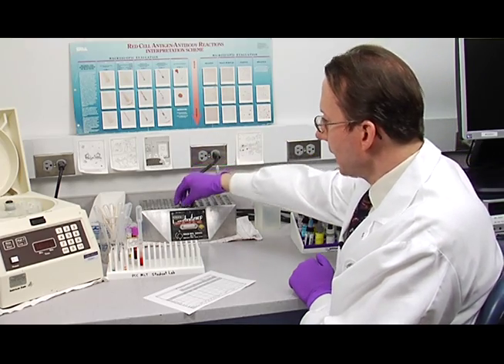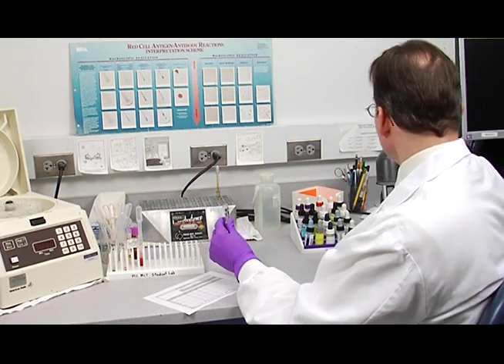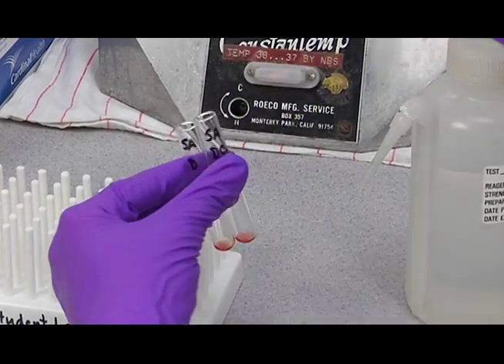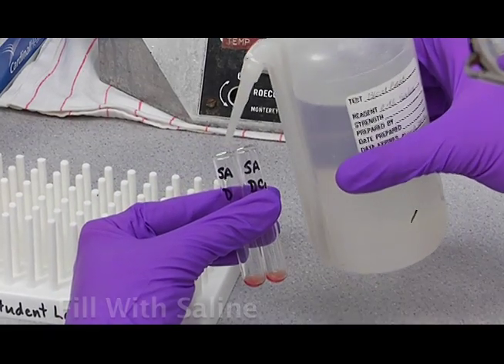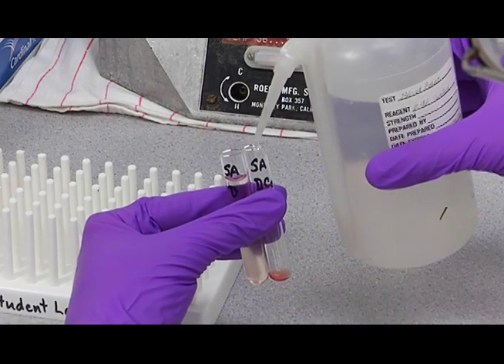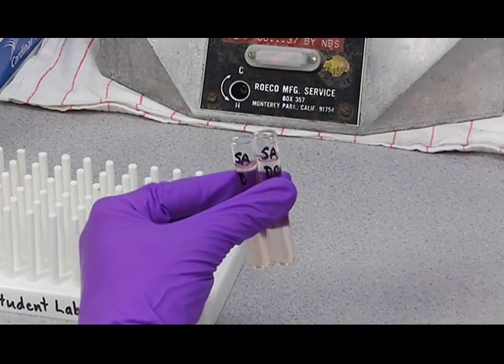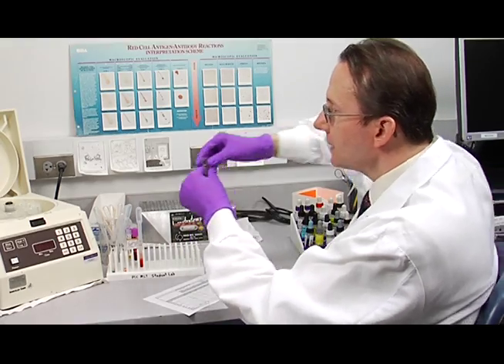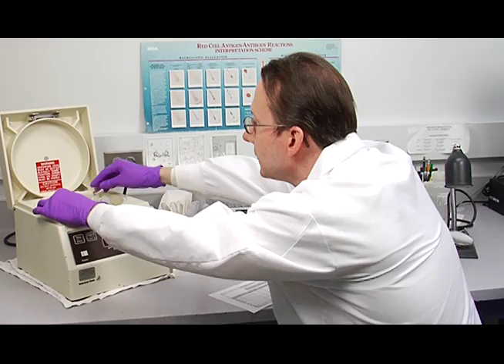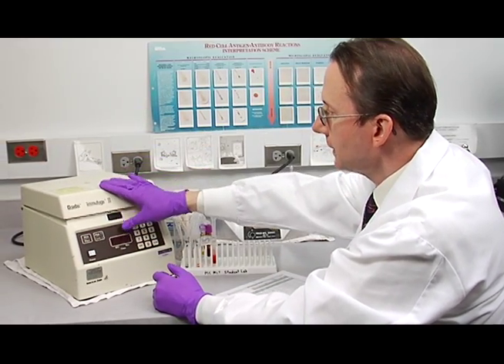After the 15 minute incubation period, take your tubes out of the heat block and fill the tubes with saline. Then place them in the centrifuge. Make sure you balance them across from each other. You also need to make sure that the liquid level in both tubes is very close so that they balance.